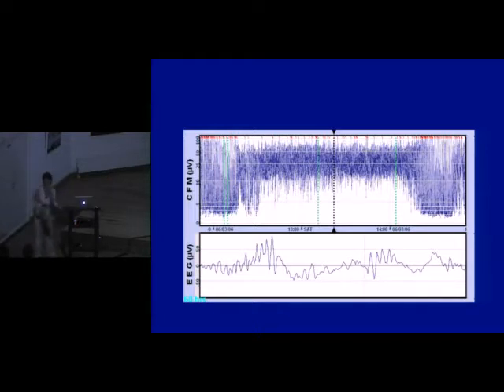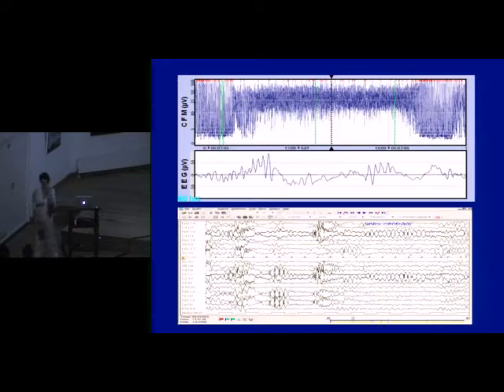And if you don't know, still the full EEG is the gold standard. So it's very important in your hospital to have a good relationship with your neurophysiologist and to have access to full EEG as well, because this baby was in status all the time. So in this whole area, this is about 2 hours of status. So if you find it difficult to interpret your aEEG and you don't have a clinical substrate, please ask your neurophysiologist to do a full EEG and to check on your aEEG.